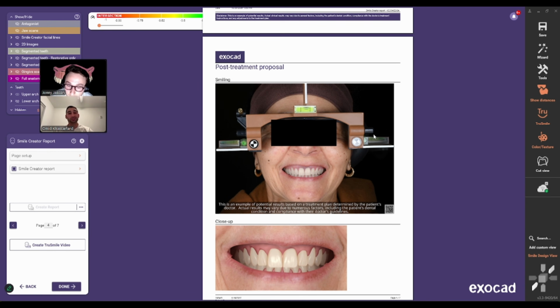And this lady in particular, it just shows the power of this feature. She was already ready to go and purchase a new home. Literally the next day when I presented this to her, she said, I was about to purchase a new home, but I'm gonna go ahead and go forward with this process. So it's crazy, the visuals really help. That's the point. It really is.